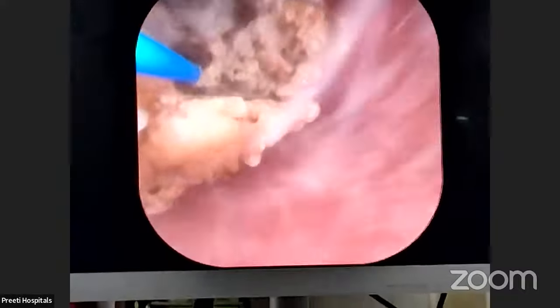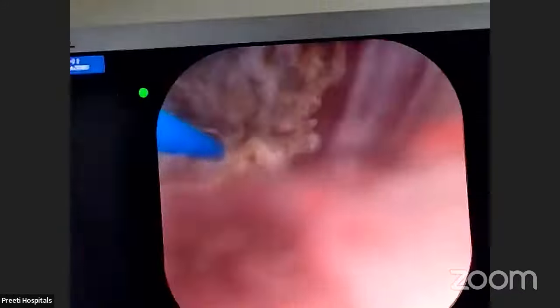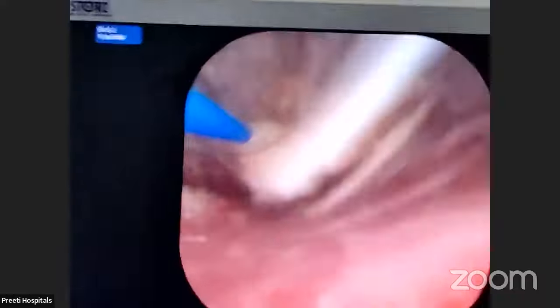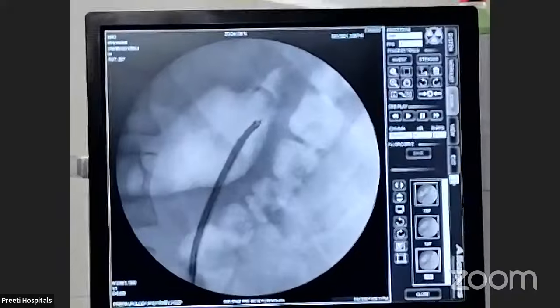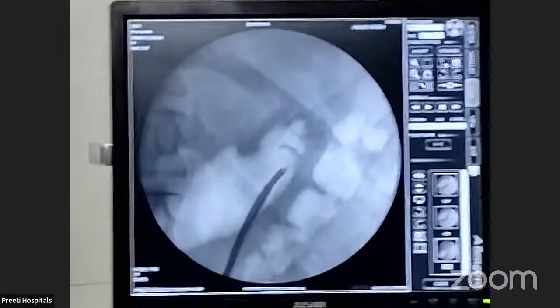But I wanted to do powder only, so that a smaller number of fragments will be there at the end to suck out. So now I am doing lasing in the upper calyx. Can you show how high I am in the C-arm? Yeah, I am very high in the C-arm. See, there is a rib above the 12th rib. So no fear wherever you are.